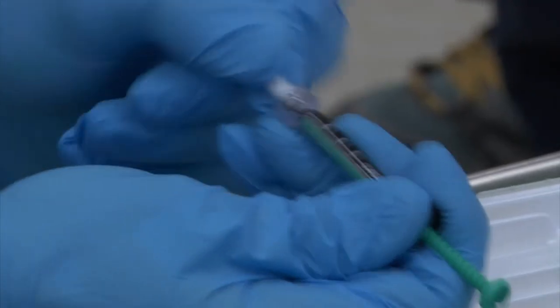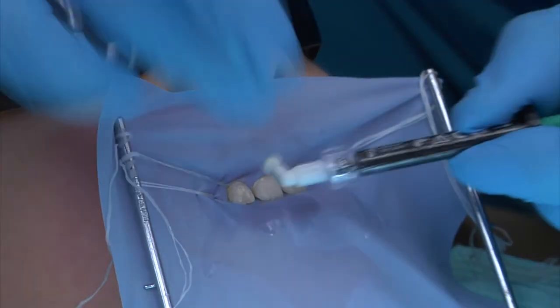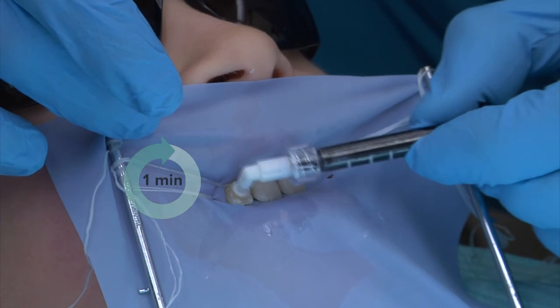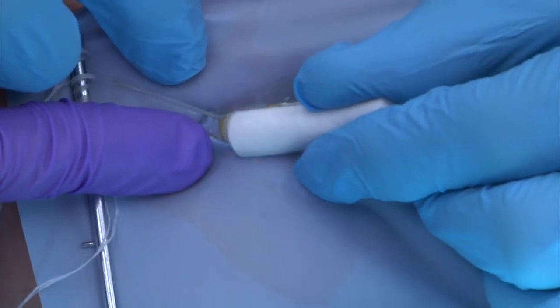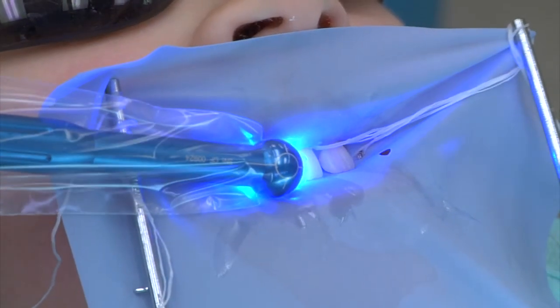Place a new applicator tip onto the Icon Infiltrant syringe. Then apply a second application of the Icon resin material for a 1-minute period. This is in order to fully treat the surface and to allow maximum penetration of the Icon material. Again, remove excess resin with a cotton roll and clean interproximal areas with dental floss. The surface is then again light cured for 40 seconds.